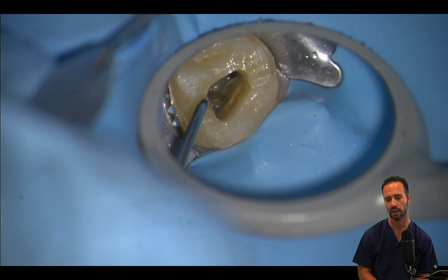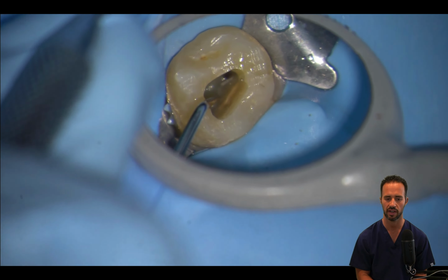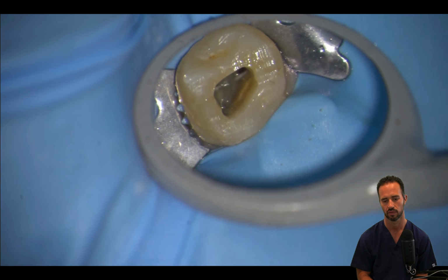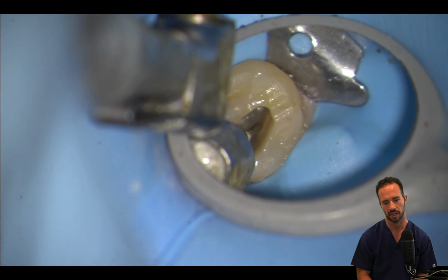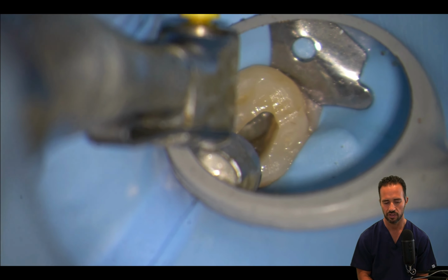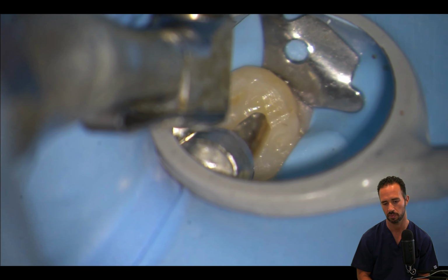So we're taking our Endo Explorer and we're poking nice and hard right into that area, trying to see if we can break into an MB2. So I like to use my ProTaper Bold SX orifice opener and just kind of peck in the area of where that MB2 is supposed to be.